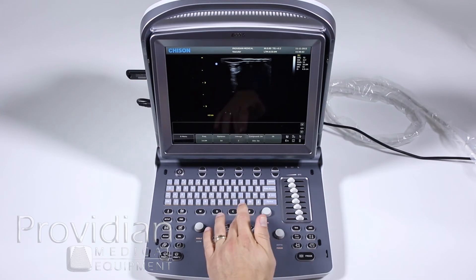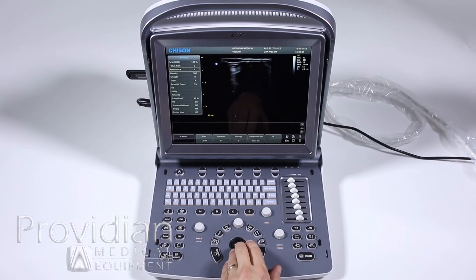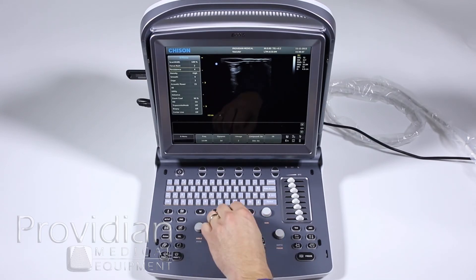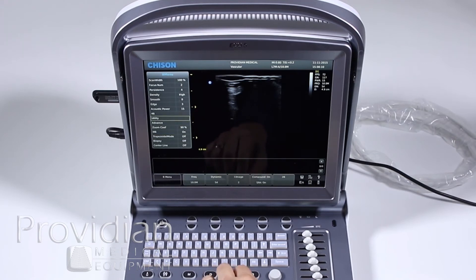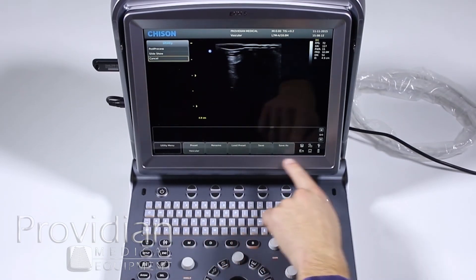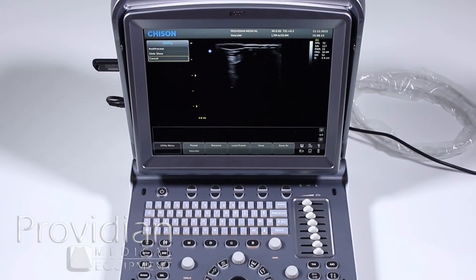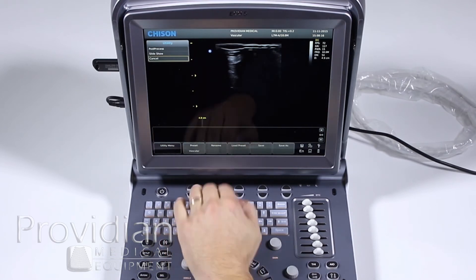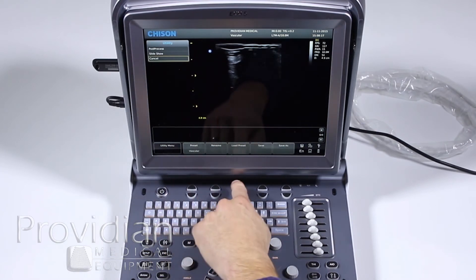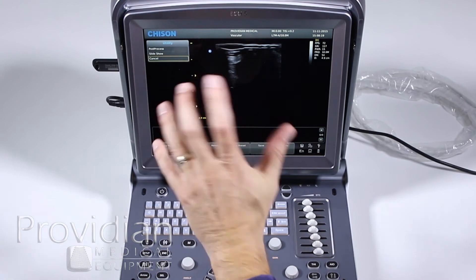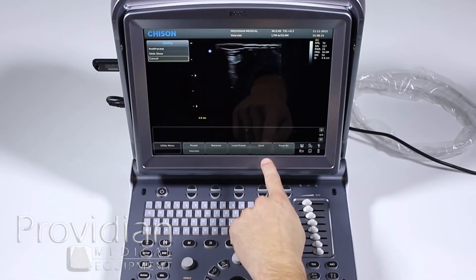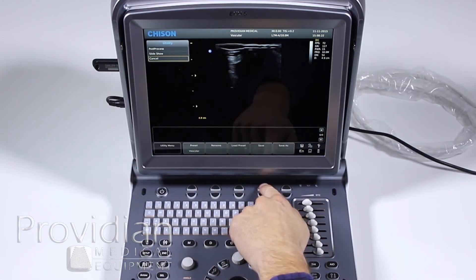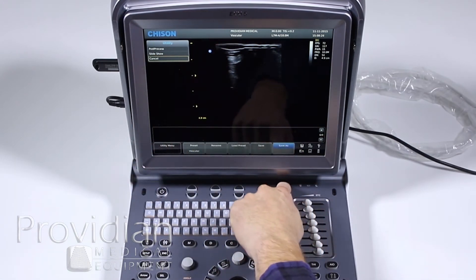To do that, we're going to hit the menu key and go down to utility. Down here, this menu has changed. It says preset is vascular. I can either rename the preset with this, load a previous preset so I can change overall, but what I want to do here is save as. So I'm going to hit save as.